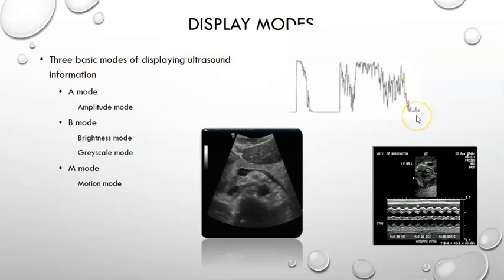It doesn't look like an image that you would think of, but what this represents is one scan line through our image.